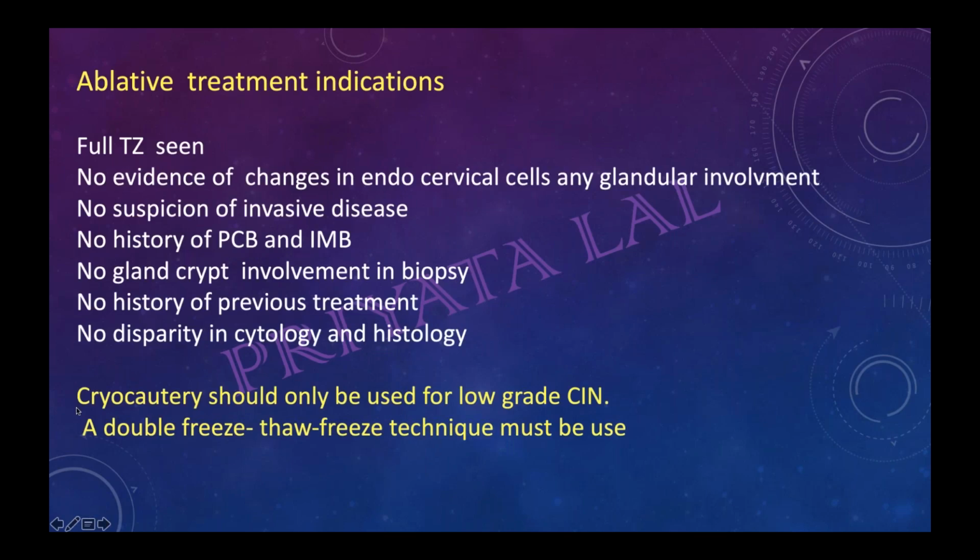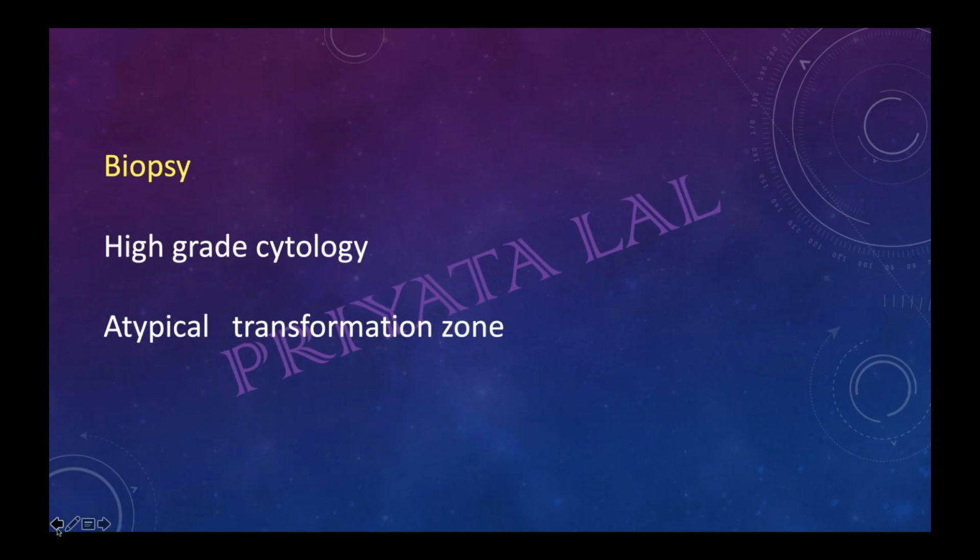Excuse me, ma'am. Ma'am, what do we mean by atypical transformation zone? If you are not able to see it, or if you are finding some abnormal colposcopic findings.